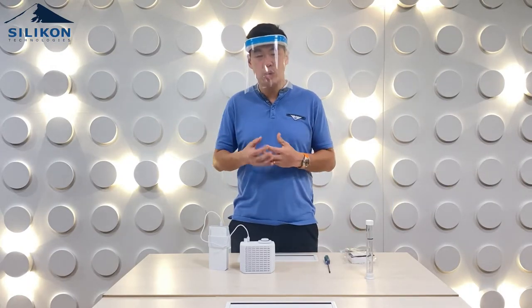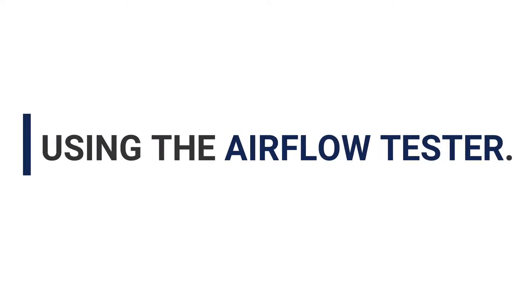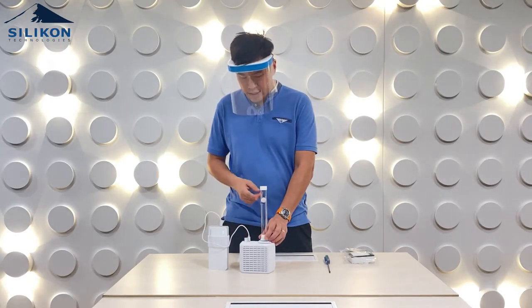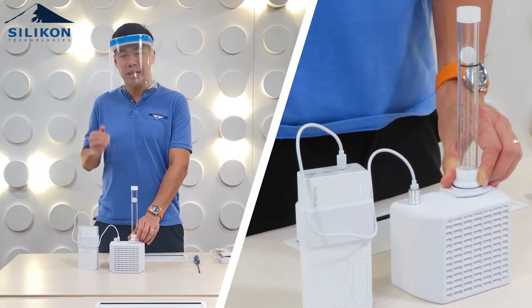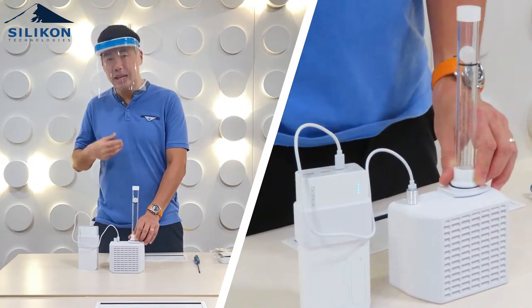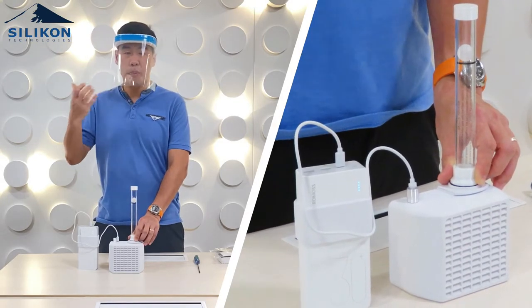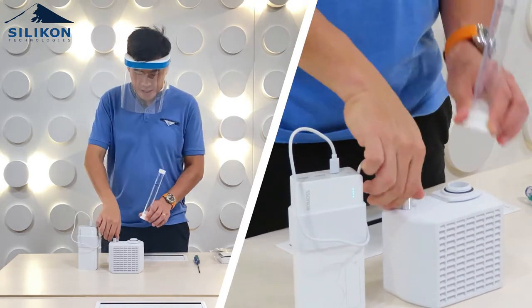One black and white way to show if the filter is still usable is to use the airflow tester. It's very easy to use — you just turn it on and as long as the ball always exceeds the black line, you're always above 250 liters, which means you can mechanically still keep using your HEPA filter. Again, once it's open from the plastic container, its storage life whether you use it or not is up to six months.